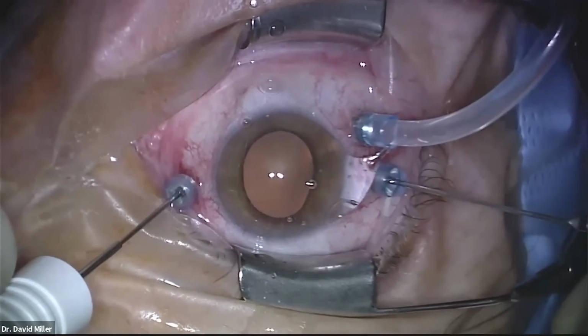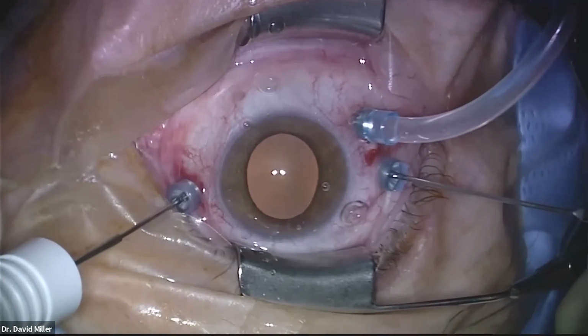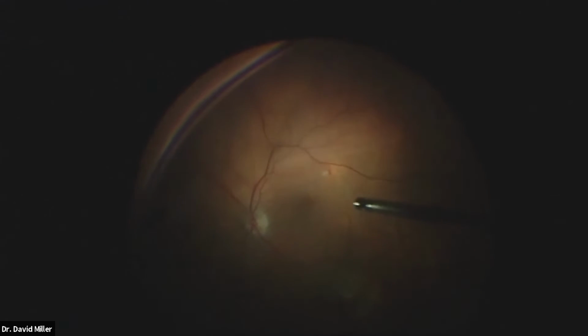So a couple of things we notice right out of the gate is, one, the lens isn't that bad. He's phakic, but I don't see that much of a cataract. So I think that's a big help. Don't have to worry about fragging the lens. We're going to zoom it in here, see what we got.